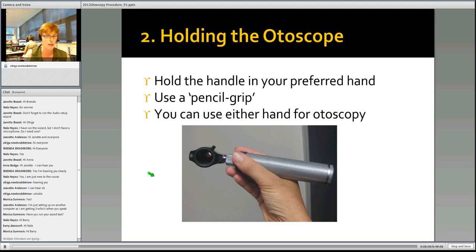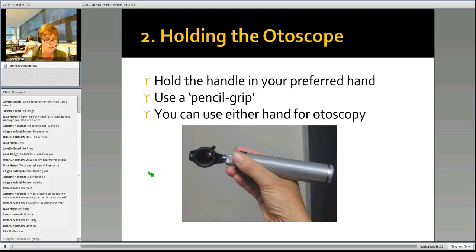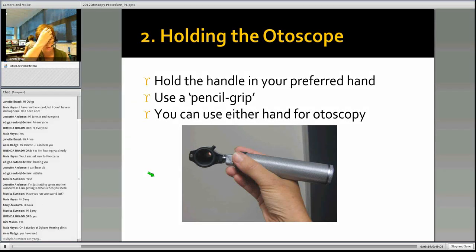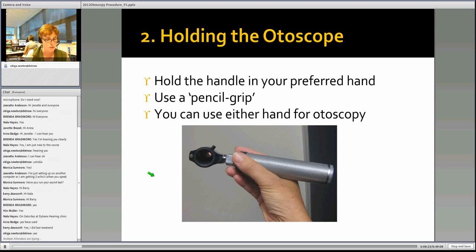Has anyone had a go at otoscopy at all? Have they had a chance to hold an otoscope? Brenda has, good. Kim has, yes. Good, Nala, that's good that you had a go on the weekend. Excellent, Barry. And Obega has as well. Did you all specifically use just one hand, or did you swap between hands?